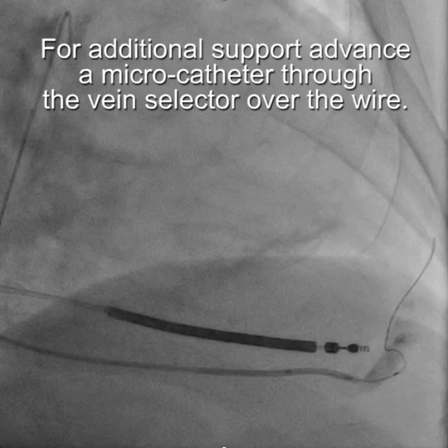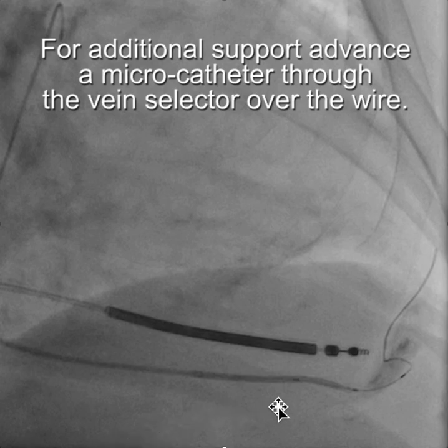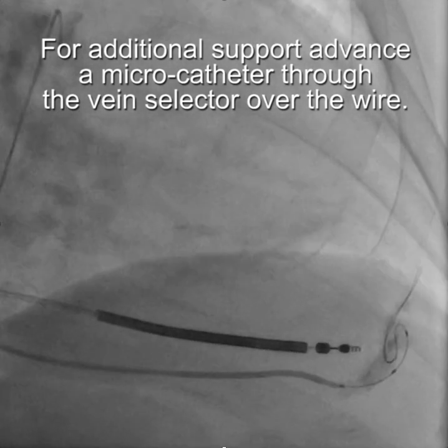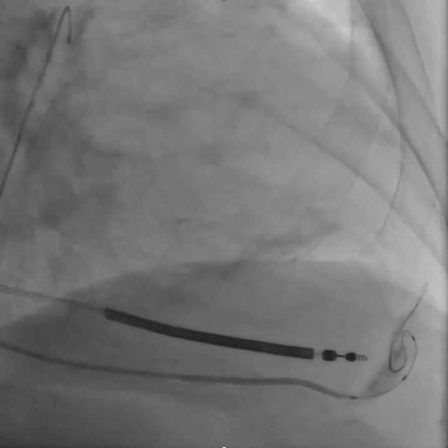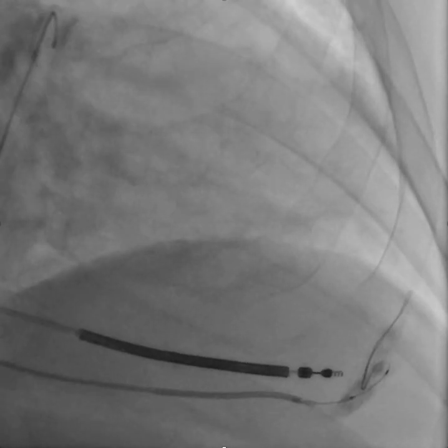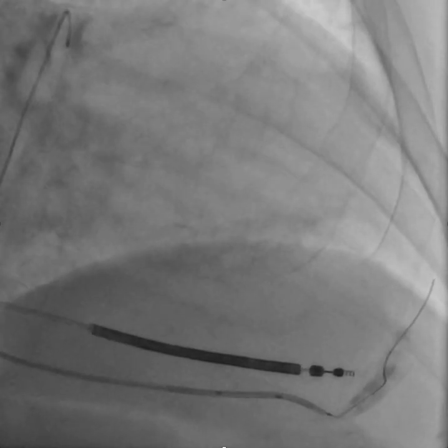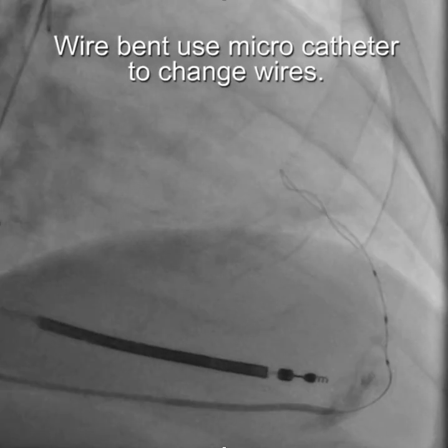So here's where the microcatheter comes into play. We're advancing the microcatheter over the wire through the vein selector. Eventually we got the microcatheter up into the collateral, as illustrated here. Now the microcatheter is up in the collateral, but the wire is bent.